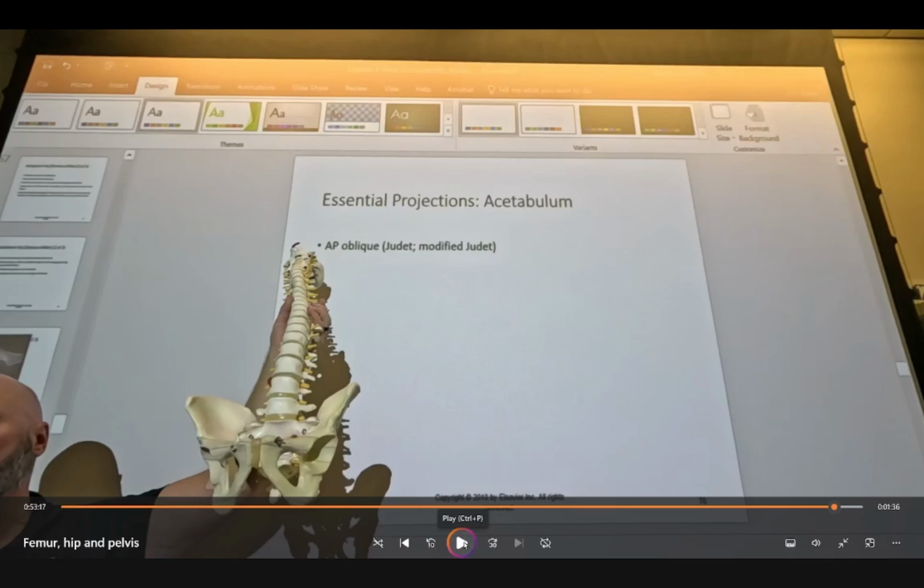They're foreshortened in that they're not parallel to the image receptor. They kind of have that downward slope, but they're perpendicular to the way they would be angled from top to bottom. All right, so they're less foreshortened than what they would have otherwise been. So our likelihood of seeing a fracture of those anterior pelvic bones is much better, and we didn't have to oblique the patient in order to get it.